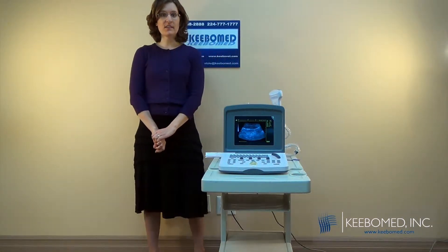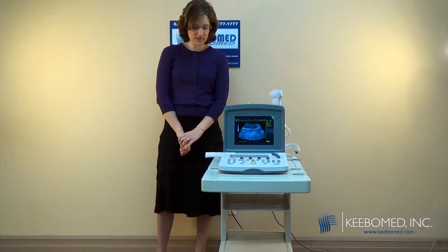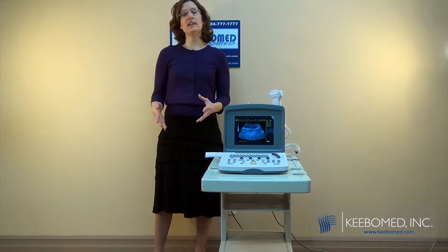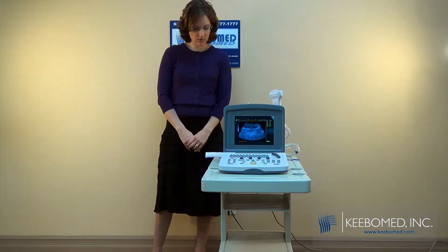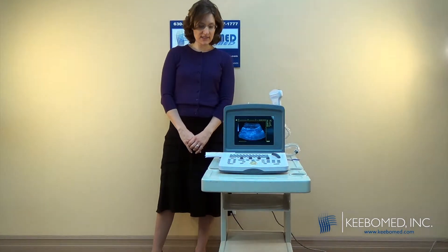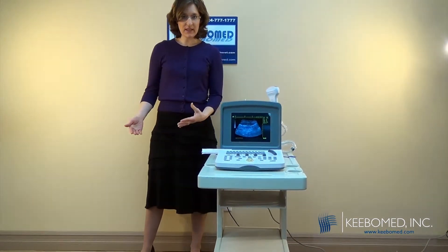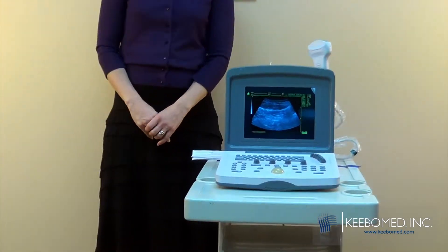Today we're going to talk about the WED9618. The WED9618B is one of our best-selling ultrasounds. We sold hundreds in the United States and thousands throughout the world. What's remarkable about the WED9618 is its reliability. We've sold so many and we haven't had problems with it.